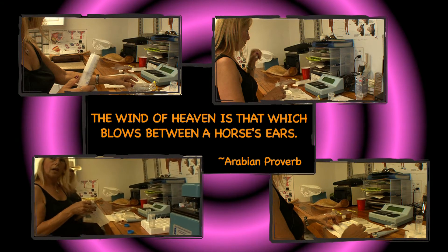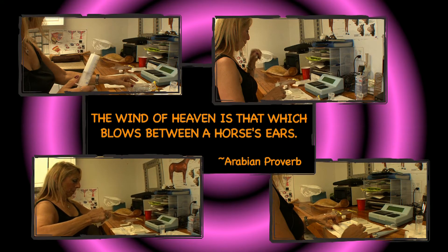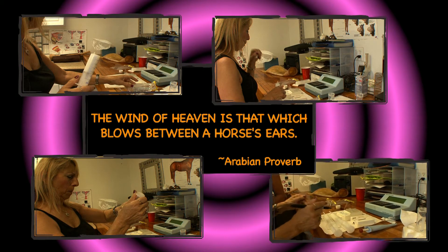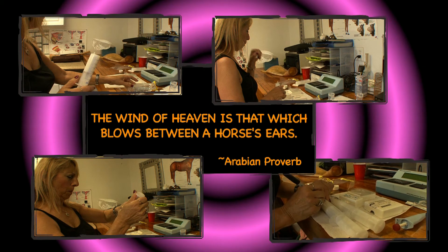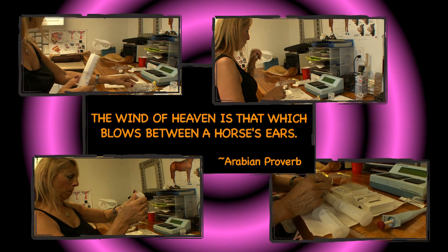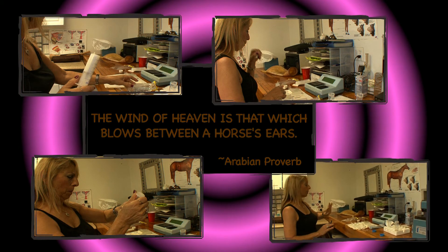Get another syringe and we'll be done in just a minute. Another thing I like to do is mark my syringes so nobody ever makes a mistake — this is the correct stallion. So I'm just going to write the mare on both of these and the date: 4/13. Sometimes these get to a vet clinic and a busy vet is going to have so many lined up, so it's a good idea to have everything marked so there is never any question.